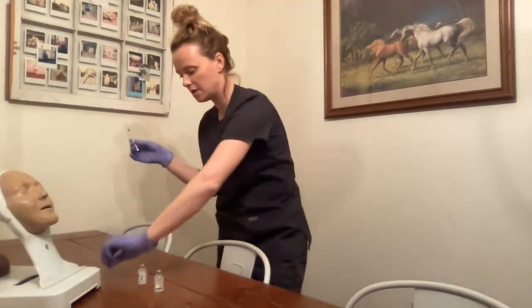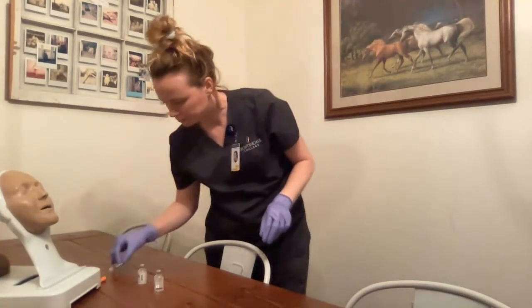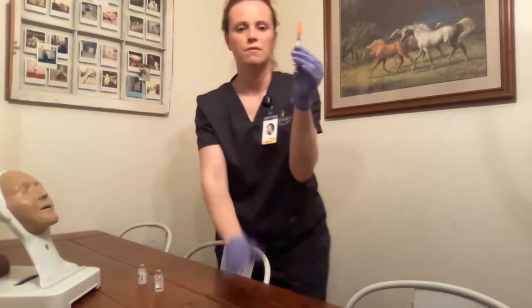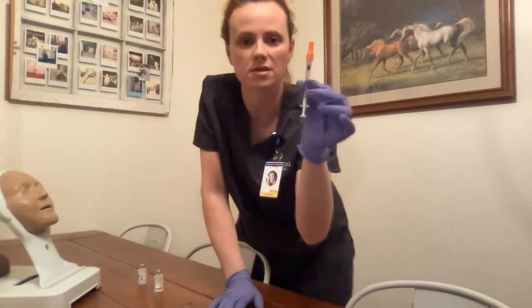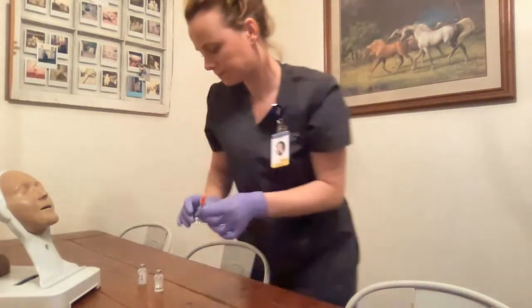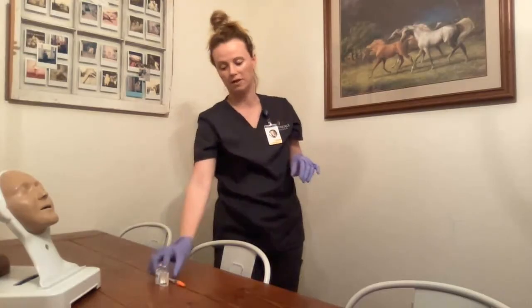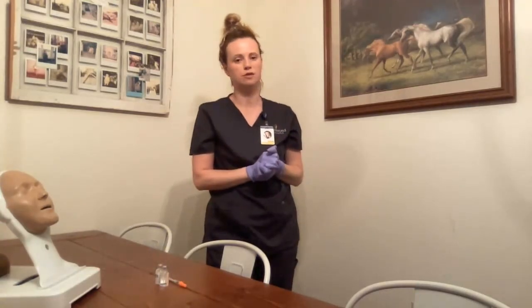I recap the needle using the scoop method. For the final and last time, the nurse and I verify against the MAR — 12 units of insulin for my patient. Medication is all ready to go. If I was preparing this away from the bedside, I would label the medication vial with the patient's name and the dosage amount.